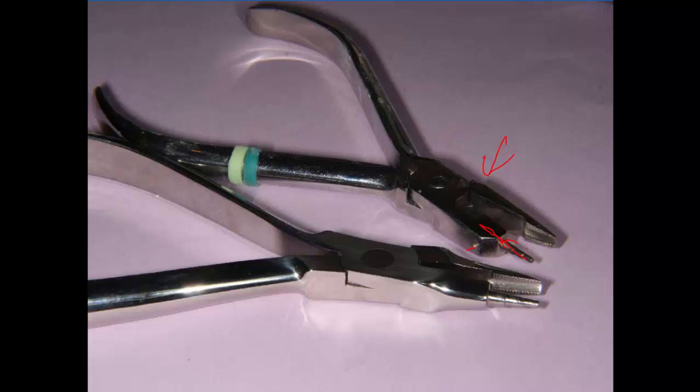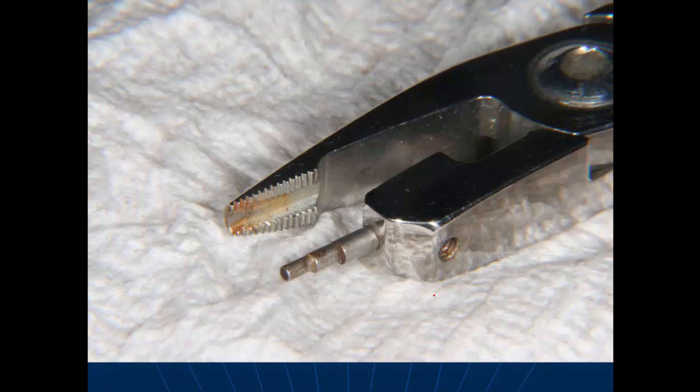This plier, the bending bar that comes out, this one's in 3 different diameters. This one has 3 diameters on it also, but the bar is made out of the same material the plier is made out of, and once it breaks, then the plier isn't any good anymore. So the other one will hold up.